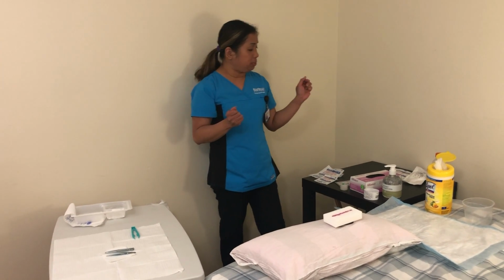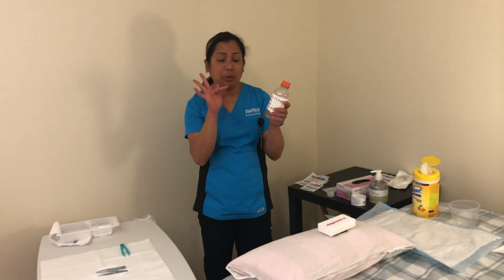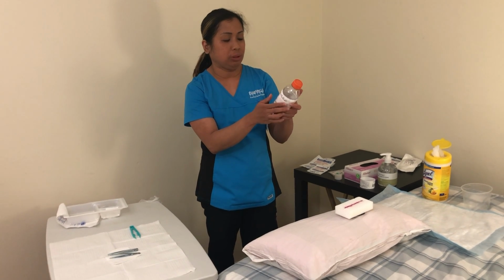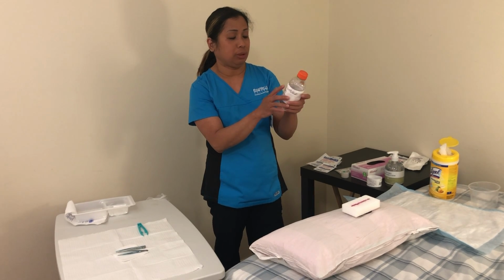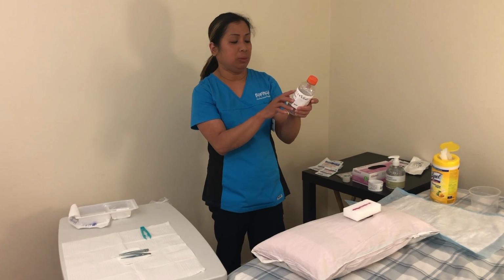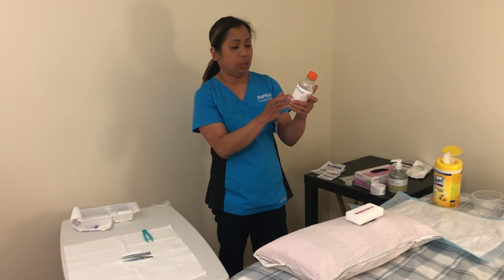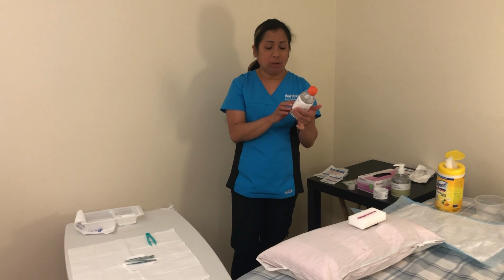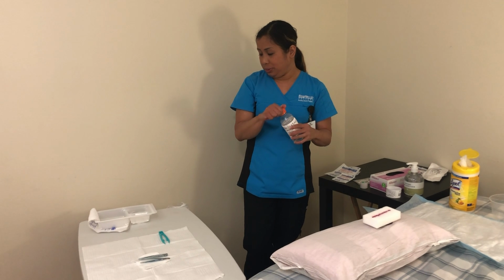Now I will grab my normal saline. As I mentioned earlier, I will mention it 3 times, the 3 checks. Normal saline 0.9% sodium chloride for 1 dressing. Expiration date July 2021. So the date opened, it was yesterday, October 14, 2020 at 1800 hours. So I will open this one now.